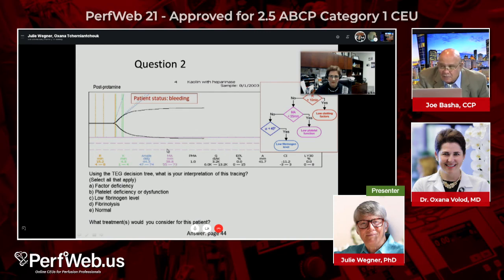Yep. Somebody guessed. Hold on, let me go to the chat. Somebody said, "What's the MA?" Meerkat Supreme picked A and wants to know what the MA is. Oh, it's 38.8. Well, I agree with Meerkat. Oh, no, he said maybe B as well. I'm going to stay firmly on A. I say it's A.